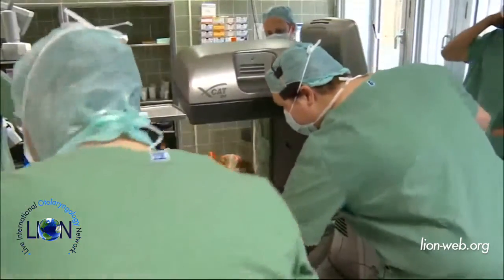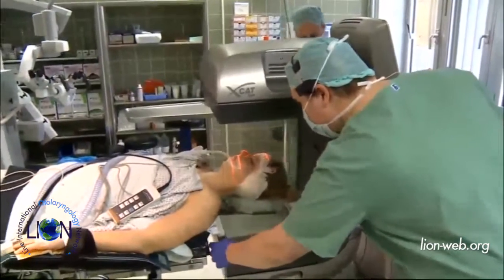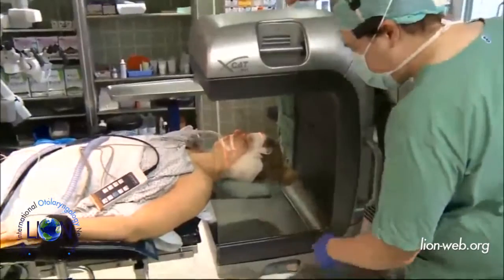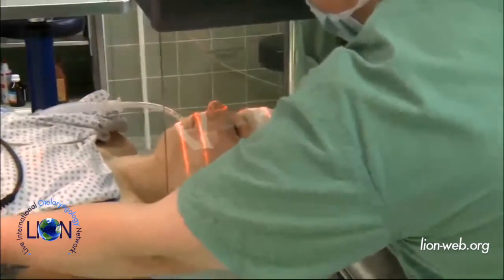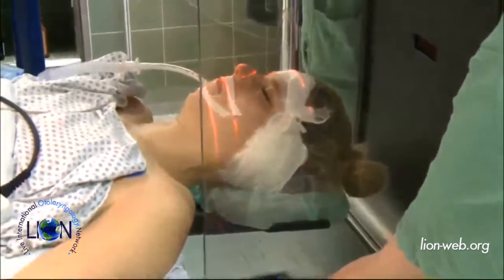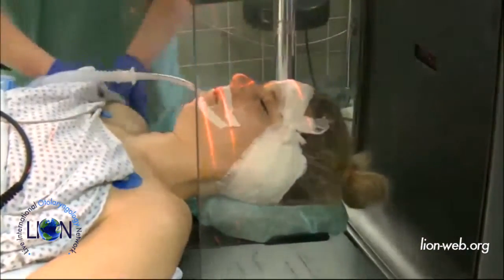You can see the laser marks on the patient now. Just a little bit up — okay, we think we are quite fine. You can just brake. Thanks. Now we will make a test to see if it goes around the patient's head — everything is fine, no contact to the body. Nicely done.